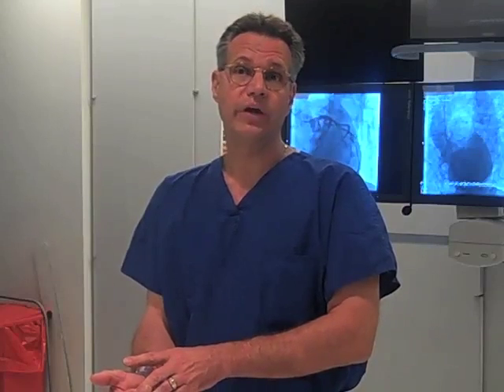But from the access of the radial artery, we've done any of the procedures that we normally do from the femoral artery, including stent placement, hemodynamic assessments, crossing valves, even doing peripheral vascular evaluations. All of it can be done through the arterial access in the wrist. The only real exception would be if someone would require a very large size catheter system for something like an intra-aortic balloon pump. That could not be done through this access site.